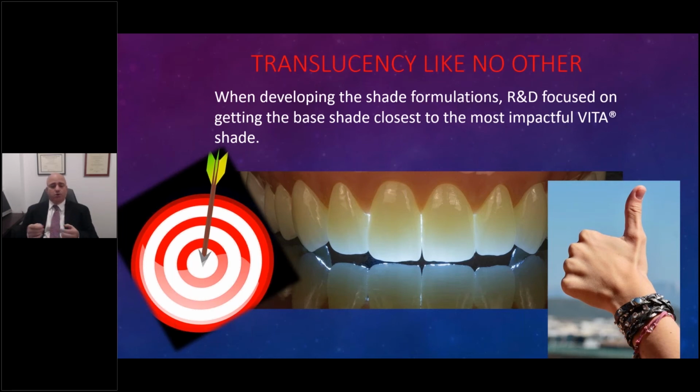We no longer even need to stain the shade that we're trying to achieve, because even if we're staining the shade, as in the former zirconias, where we tried adding to true to shade, we can match, but now we're starting to perhaps add some inconsistencies or variables that may and will affect the level of quality. Here you have it built in. It's already built into the zirconia.